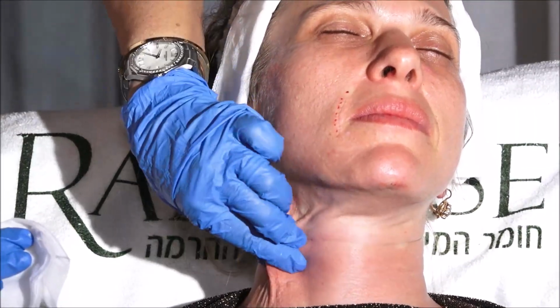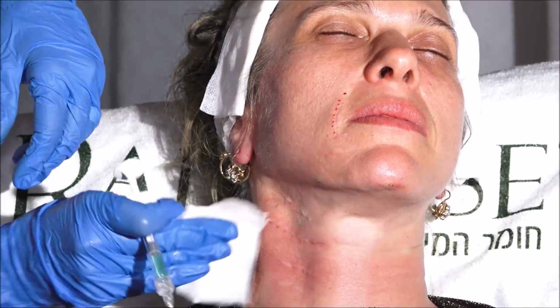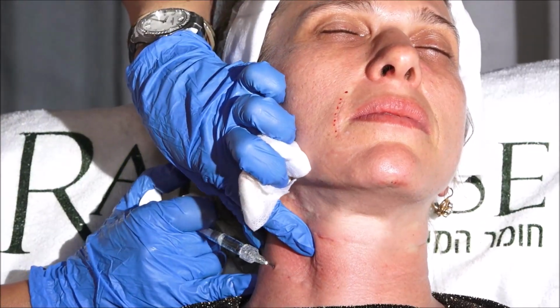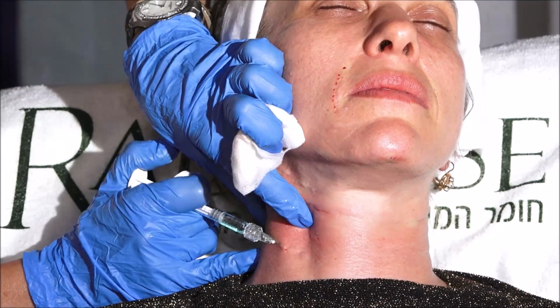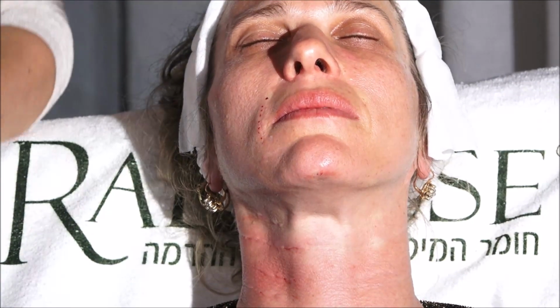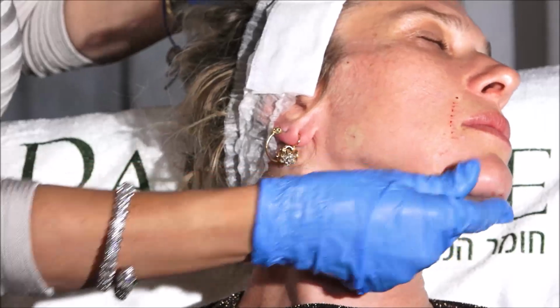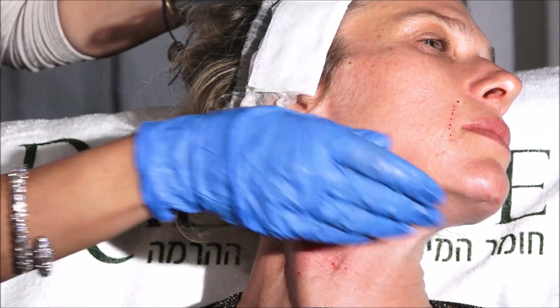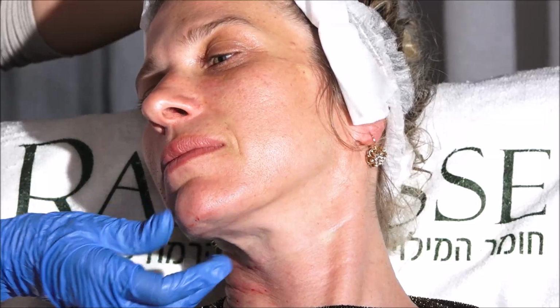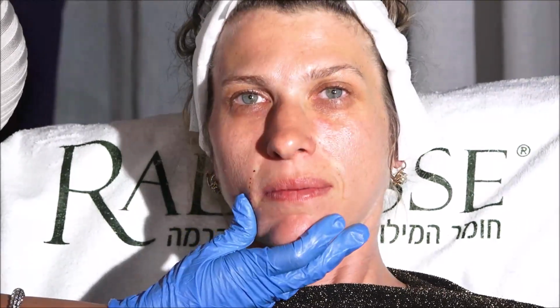So expect some edema. This edema can take 2 days to go because of the glycerol. Don't forget that. So this would be my treatment for her. She has a better contour, a better chin and jawline projection compared to this side, and a fresher look, even if you look at the nasolabial fold and how heavy the face is.